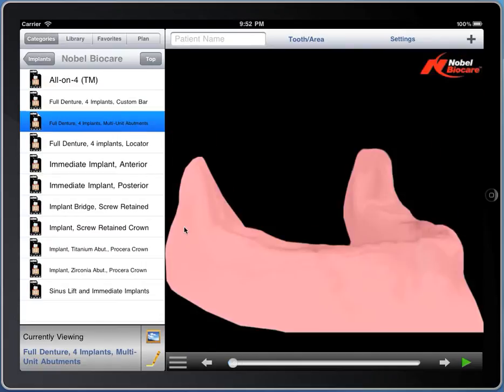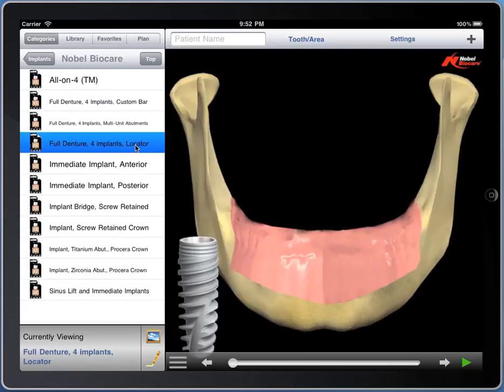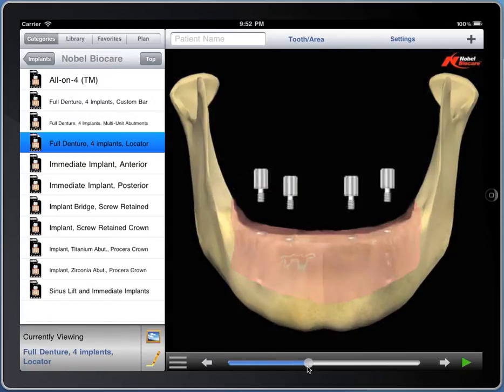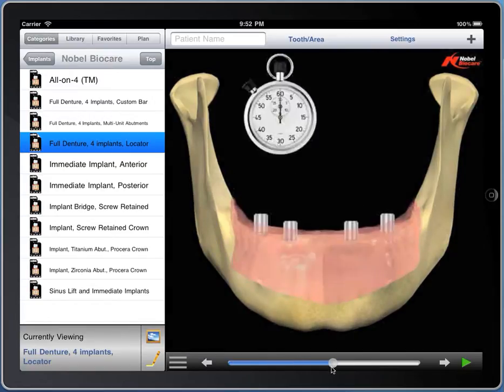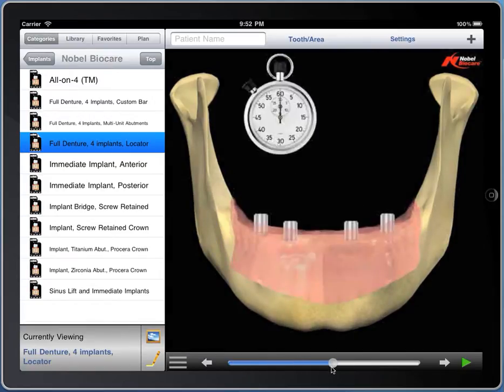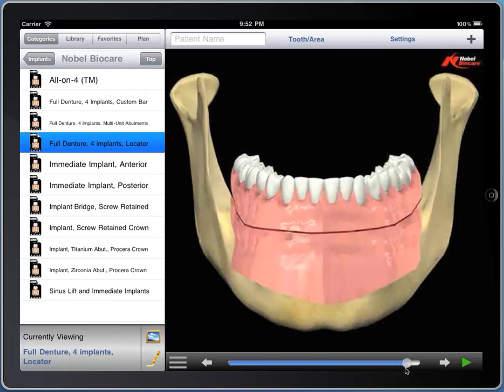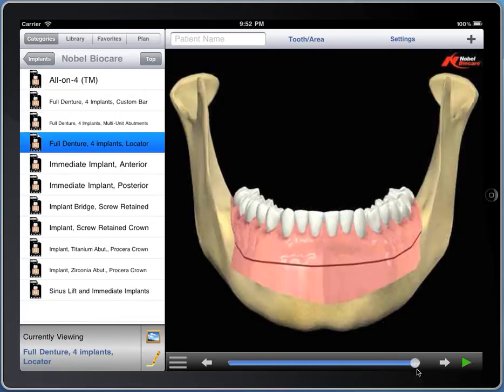This is the same as all-on-four for those that don't use the all-on-four trademark and prefer to call it multi-unit abutments. This here is more of a direct locator, non-bar approach, where the implants are placed, some time is allowed for healing, then locator abutments, and your denture.